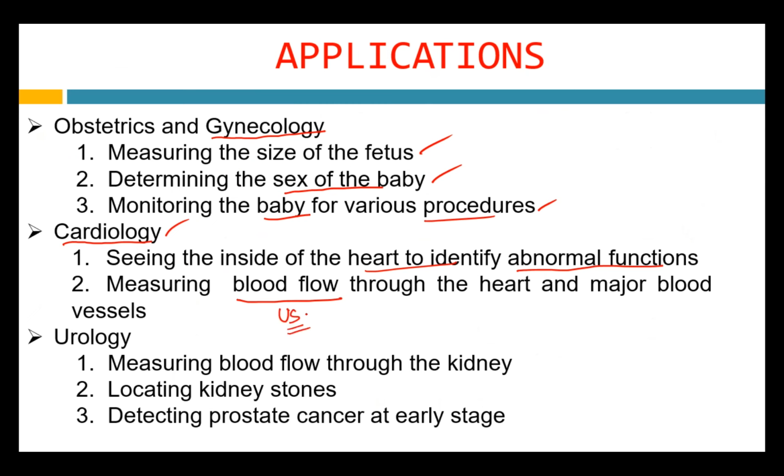Most of you have done this in your laboratory. In your final years you did this in your BMI laboratory, I think. If you have an ultrasound Doppler, you have to keep it at 45 degrees on your radial artery or on your neck, at the place where you can feel the pulse, so you can receive some sound, the ultrasound energy.